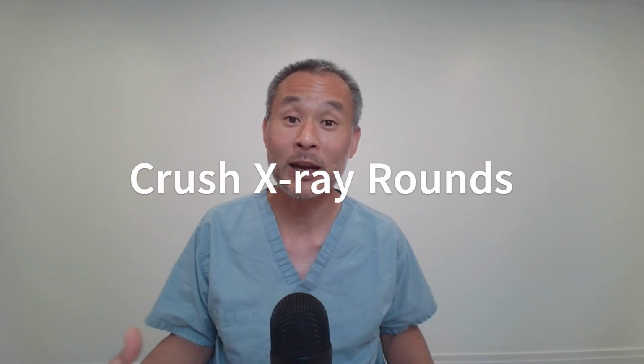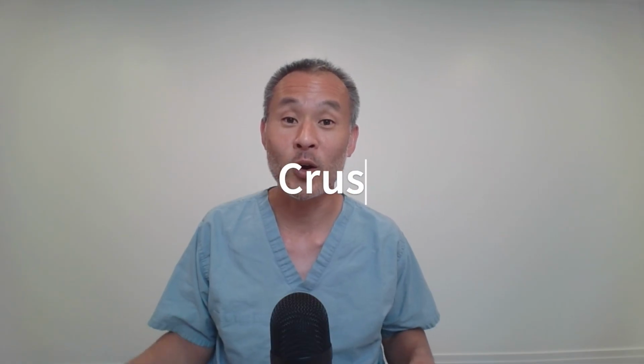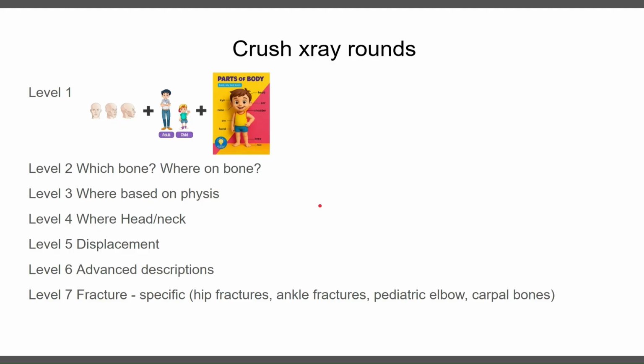This is part 2, how to read fractures. If you haven't seen part 1 already, go back and look at that. That talks about the first sentence during your presentation. So let's move on to part 2, reading fractures. So here's part 2 of Crush X-ray Rounds.